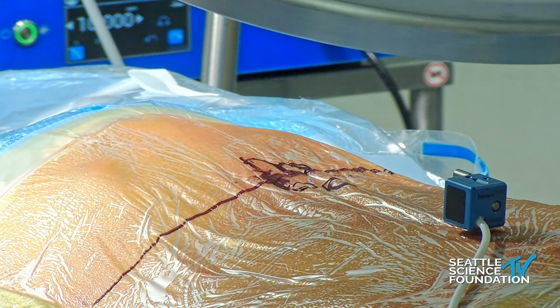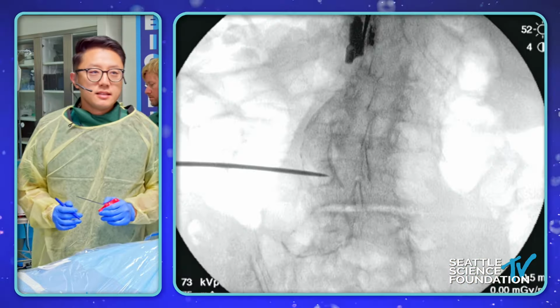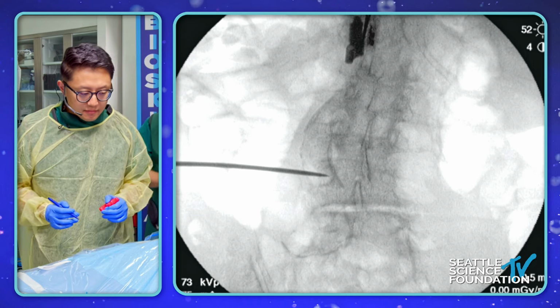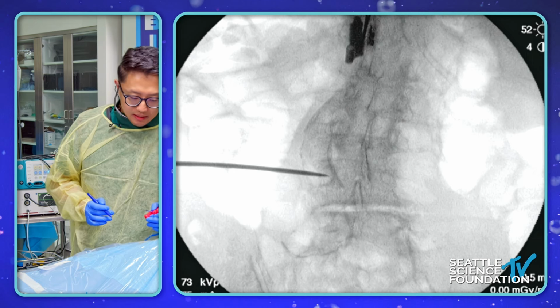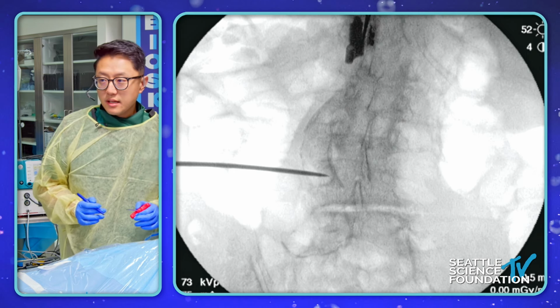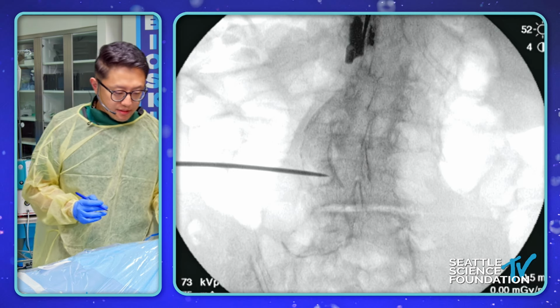So Meng, quick question here. Allude a little bit more towards what you can reach and what you cannot. So I love that you think already about migration and stuff, but where are the limits and what levels can you use this technology or this technique, and where does it not work? Yeah, so that's a great question.